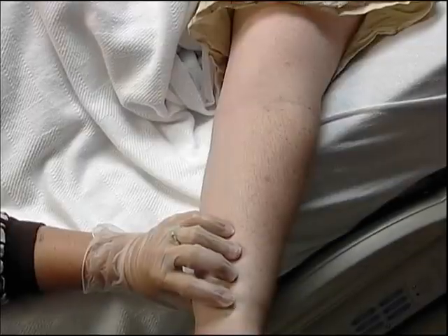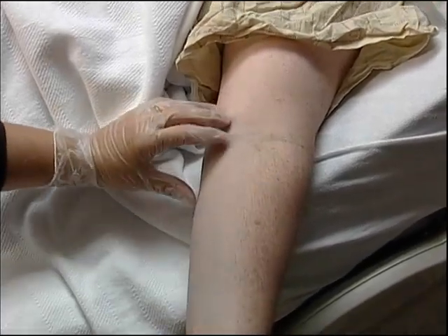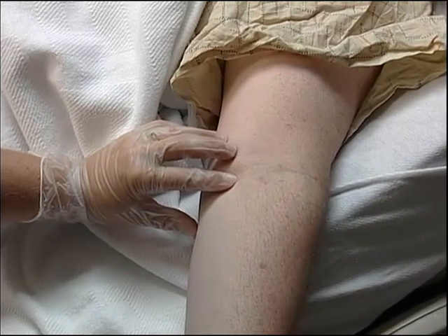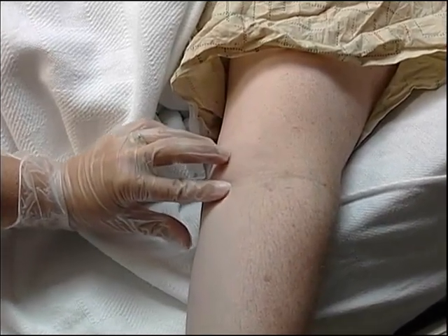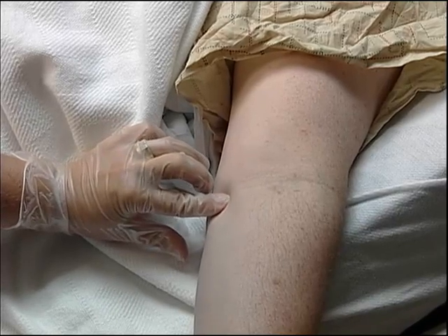Due to its depth and close proximity to nerves, the brachial artery should be considered as an alternative site only when neither radial artery can be confidently accessed. In such cases, evaluate the brachial artery in each arm to determine the best choice. In comparison to the radial artery, the brachial artery is larger and generally has a stronger pulse.